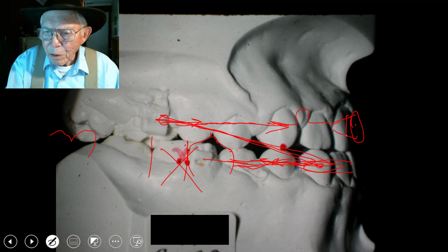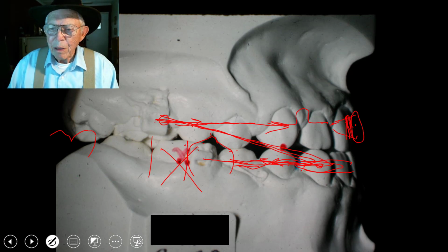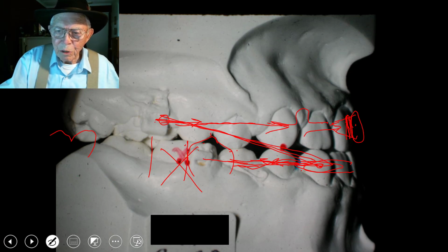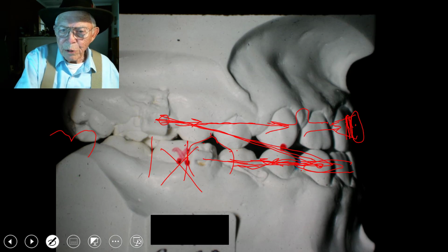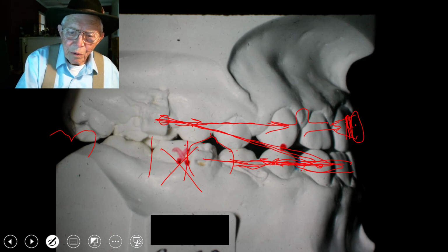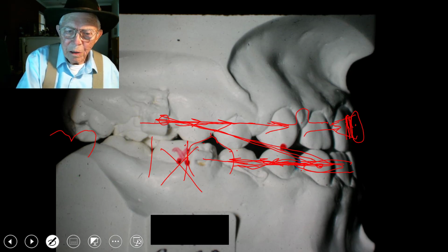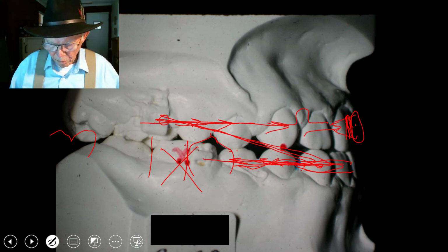And we keep a space between the lip bumper and the teeth here in the anterior part of the mouth, and that allows these teeth to move forward easily, much better than if you just push them up against the hard situation right here. So we use a lip bumper, and we use this class 3 elastic, and as the class 3 elastic is pulling these teeth back and pulling these teeth forward, we can actually correct the whole thing by using it in that fashion. And that will do the whole job.